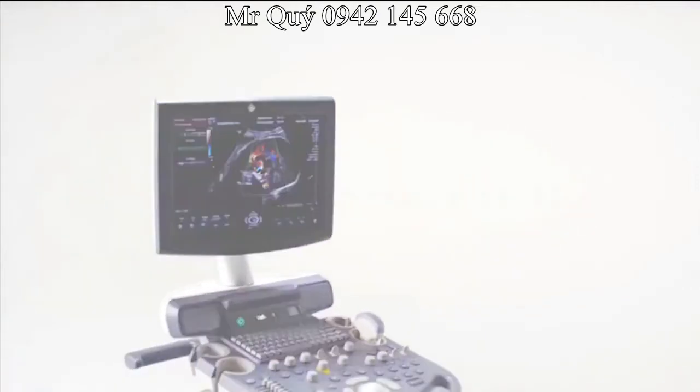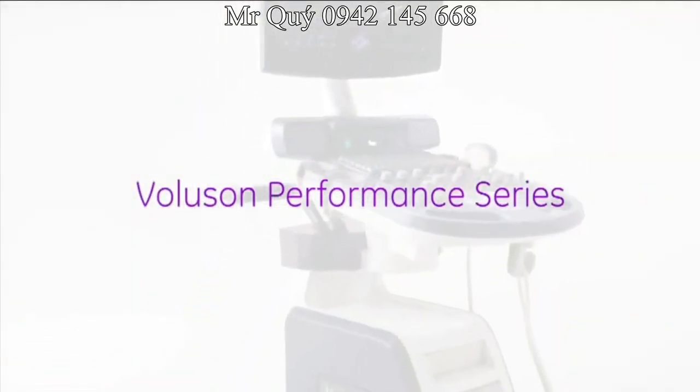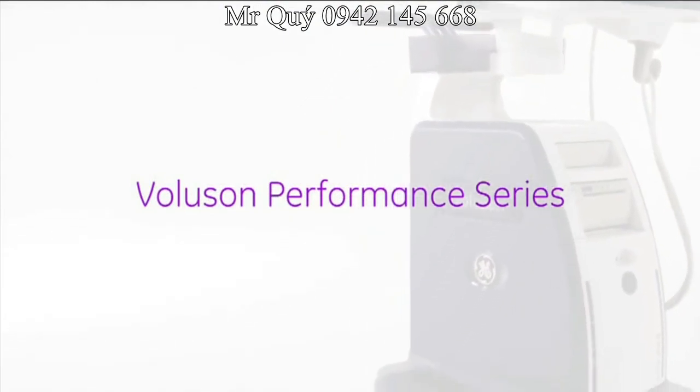The Voluson Performance series is an easy-to-use system with excellent image quality and performance to help meet the needs of your practice.